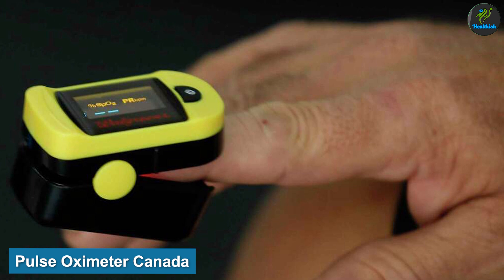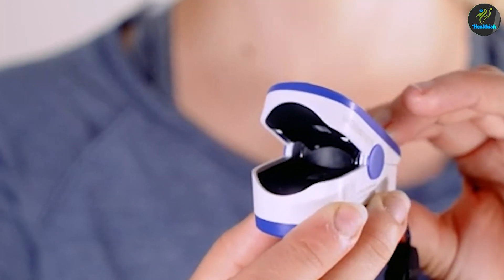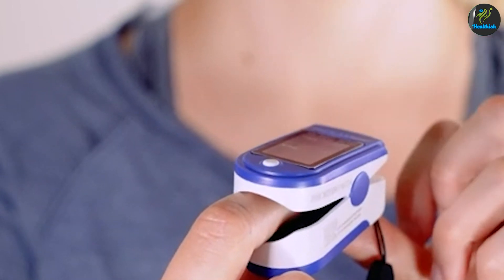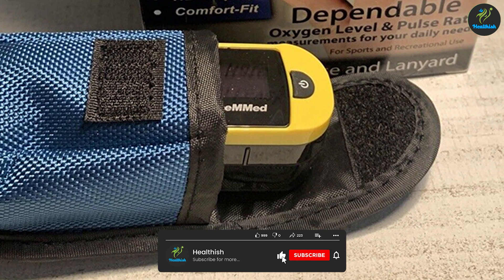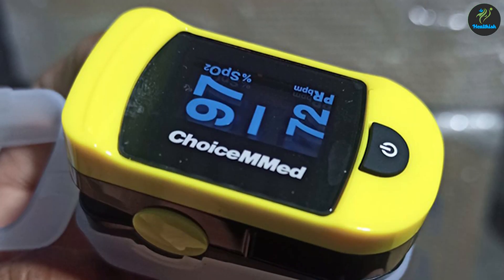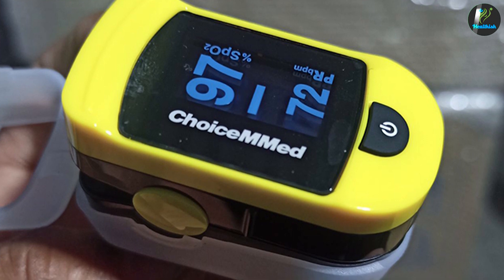Pulse oximeters are clip-on gadgets that show readings of oxygen saturation. The device can be used on the finger, wrist, foot, or any other area where blood flow can be measured. They are also great for people who have conditions that lower oxygen levels, such as sleep apnea or snoring problems. Oximeters can also give information on breathing interventions, including oxygen therapy and ventilators.